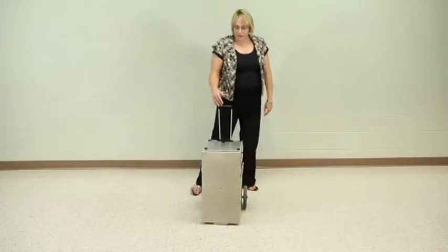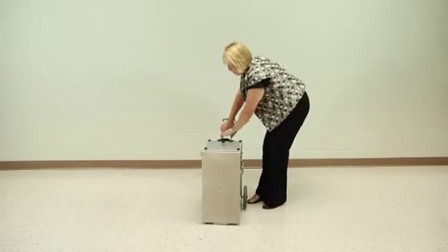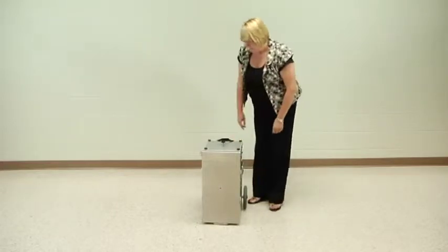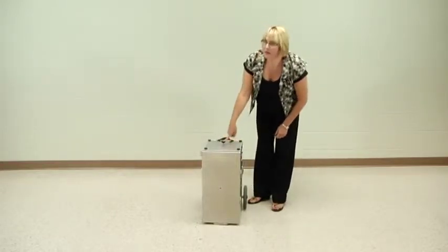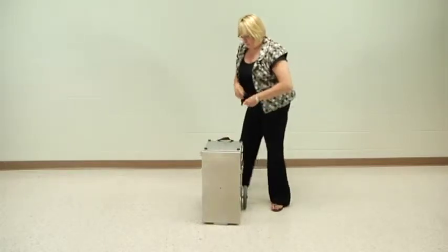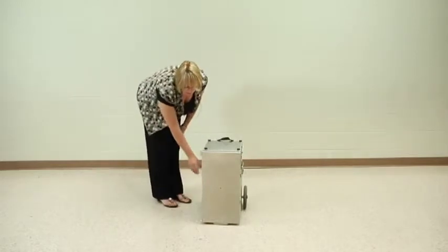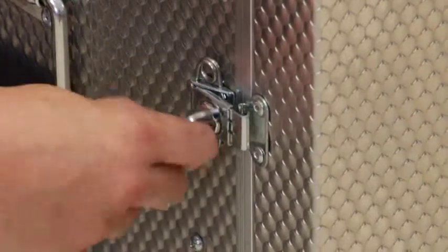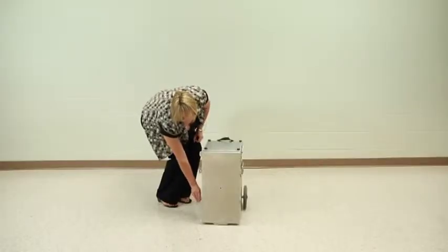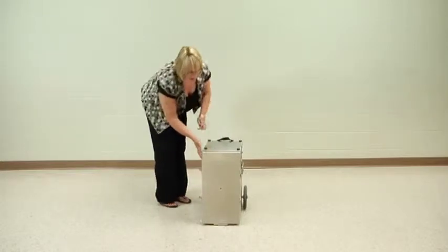Once you have the unit rolled into place, you can squeeze the handles to rotate it downward and get it out of your way. At that point, take the black knob on the top and unscrew it until it detaches from the unit. Then come over to the side front cover holders and take a quarter turn to the left, press it out of the way, and swing the door open.